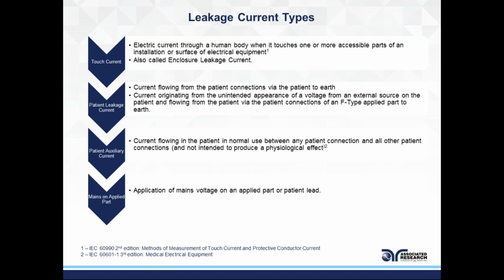It's possible that line voltage coming onto a human being while they're in the hospital bed may or may not kill them because they're sitting on a hospital bed which is isolated from ground. But it doesn't mean that the medical equipment that they're connected to could not cause additional damage to that human being. So again, the mains on applied part test takes into account a worst case scenario where a human being comes in direct contact with a line voltage, and hence it also comes when line voltages are applied to your product's applied parts section.